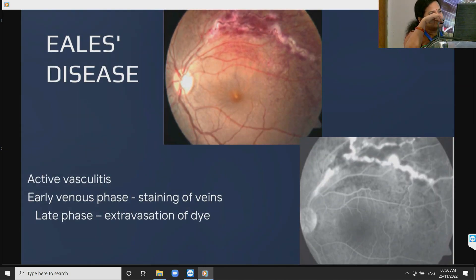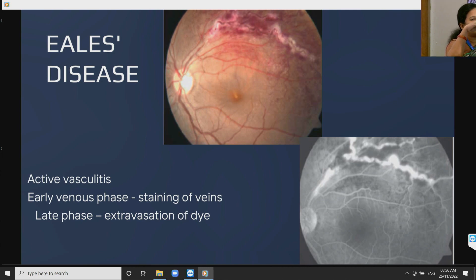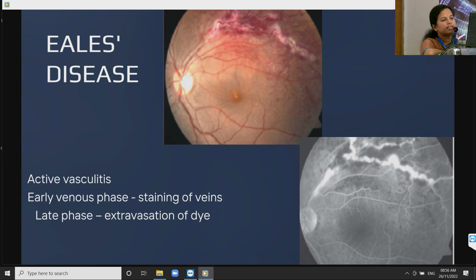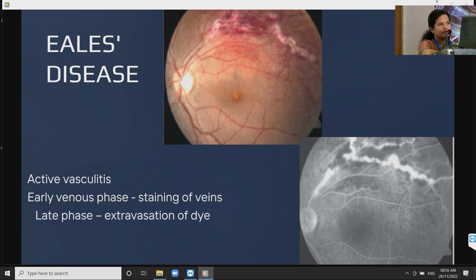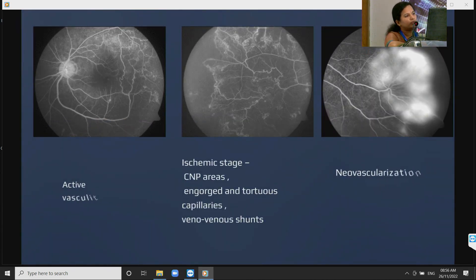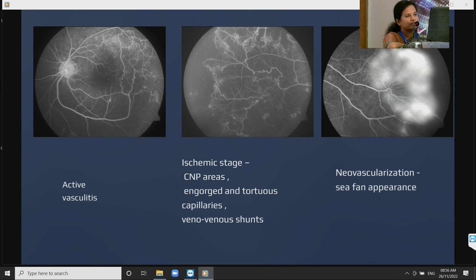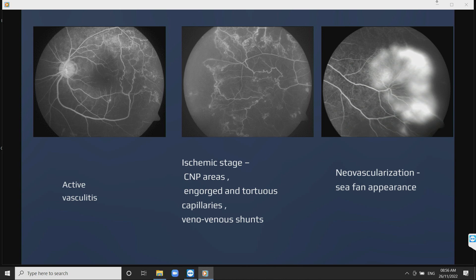In Eales' disease, in the active vasculitis phase, the early venous phase shows staining of veins with extravasation of dye in the late phase. We can classify cases into different stages according to FFA: active vasculitis phase, ischemic phase, and neovascularization phase. FFA gives an idea about the stage of the disease.